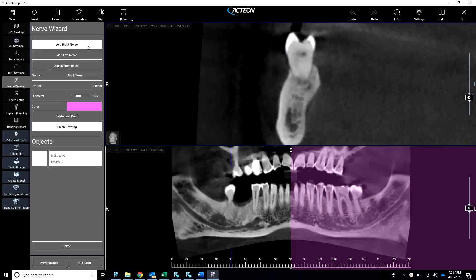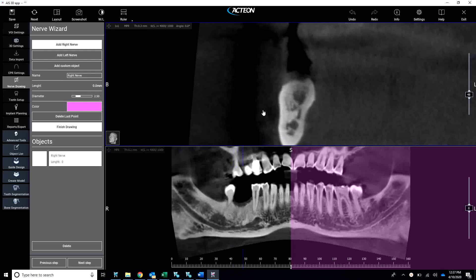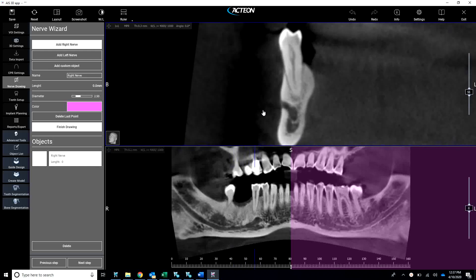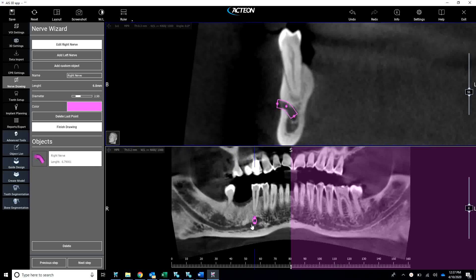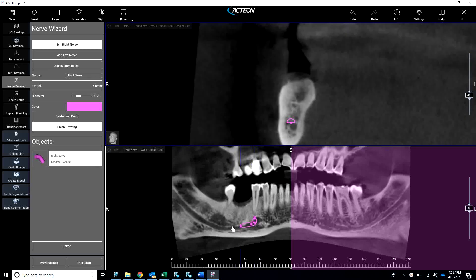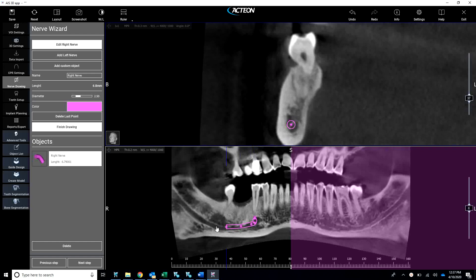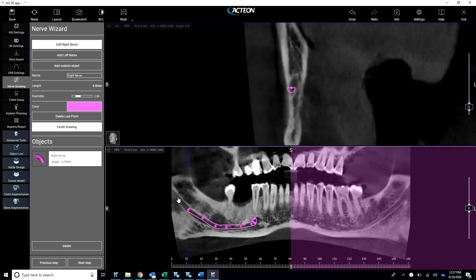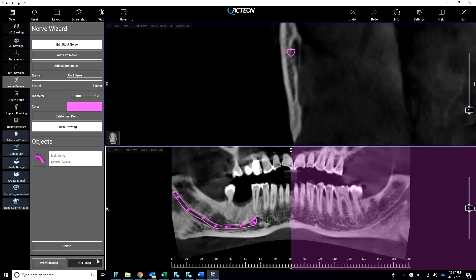We're going to add nerve. We're going to go up here to the top and scroll the mouse to find that mental foramen. There we go. We're going to continue down here at the bottom along the superior border of that nerve canal. Great. Go to next step.